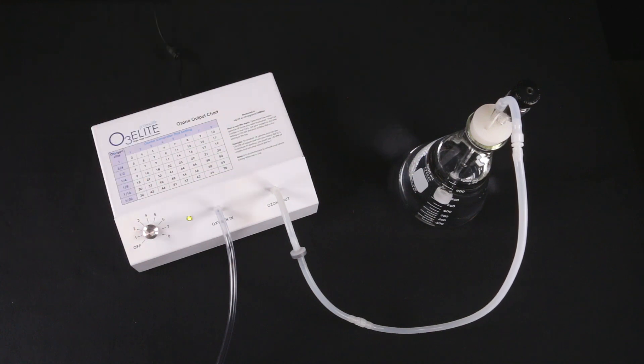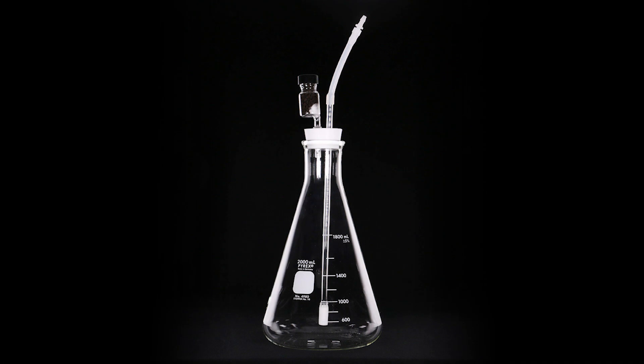That completes the setup for the 1,000 mil water bubbler. Again, to set up the 2,000 mil water bubbler, follow these same steps.